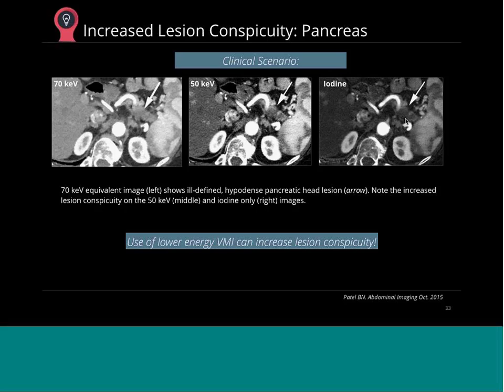Okay, pancreatic cancer is a source of a lot of anxiety for residents, fellows, and even attendings because it's hard to see. You're solving a lot of issues for patients by doing this. And it's important to see the tumor because you don't want to send a patient to surgery who shouldn't otherwise get surgery because it is a very morbid and high mortality disease. So imagine you send a patient to surgery because you said, it's probably about 7 millimeters to a centimeter. They go to surgery, first follow-up, 3 months later, they have a hepatic lesion, a metastasis already. We did not do that patient a service.